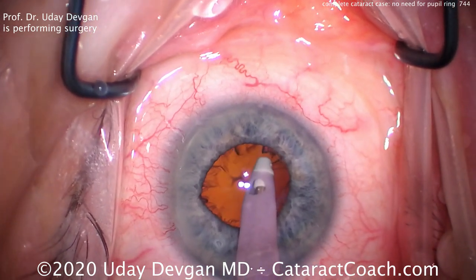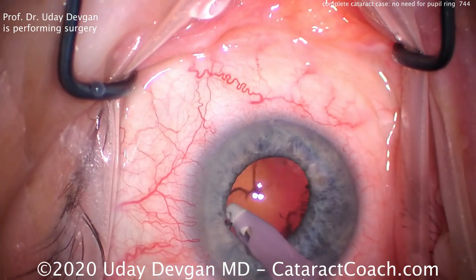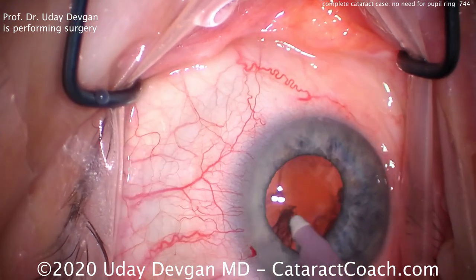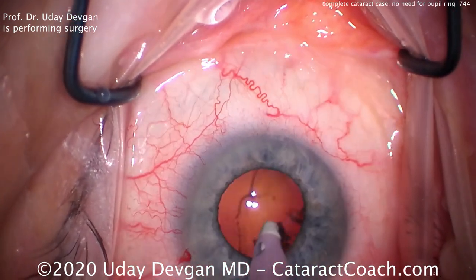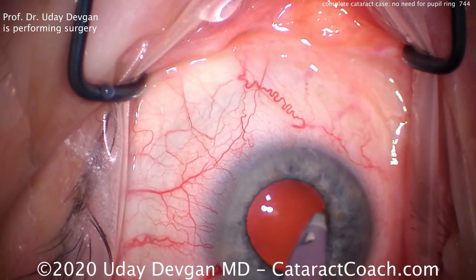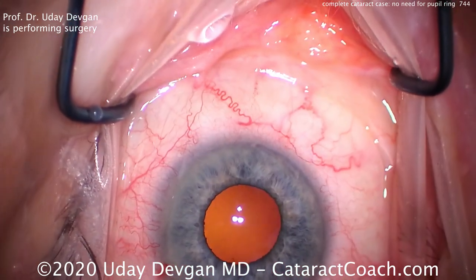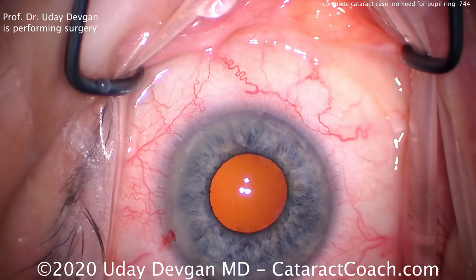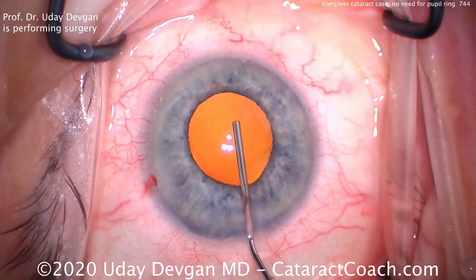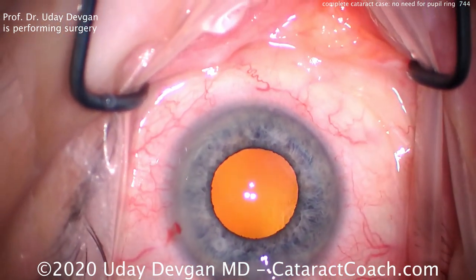Using a coaxial IA probe, we're going to go and start aspirating the cortex out. In this patient, we're using a larger 2.75mm incision, and the incision's at the 180 degree meridian because this patient has about 0.75 diopters of against-the-rule astigmatism. Removing that — that looks pretty clean. We'll place the lens in the capsular bag as well. So let's fill that bag with our cohesive viscoelastic — get a big fill here. That looks great, and that also gives us a little bit of viscomidriasis of the pupil.